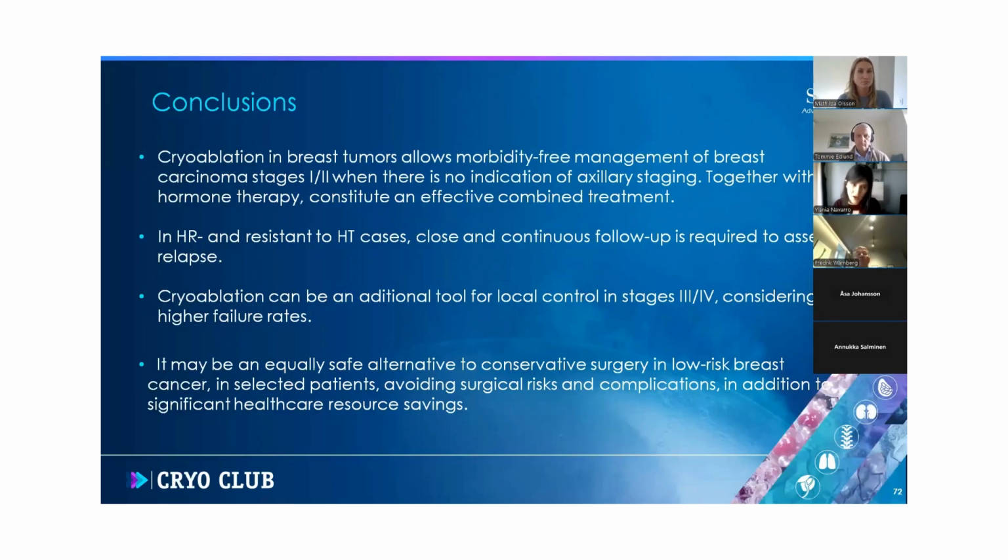So in this group of malignant lesions, we have seen that cryoablation allows morbidity-free management of breast carcinoma in early stages when there is no indication of axillary surgery, together with hormonal therapy as a combined treatment. In hormone receptors negative and resistance to hormonal treatment, we must do a close and continuous follow-up to assess possible relapses. Cryoablation can also be useful in advanced stages, as we have seen, considering, of course, higher failure rates because of the difficulties of this group. And it may also be a safe alternative to conservative surgery in low-risk breast cancer in selected patients.